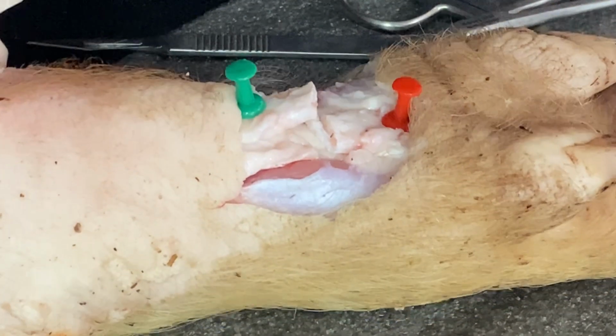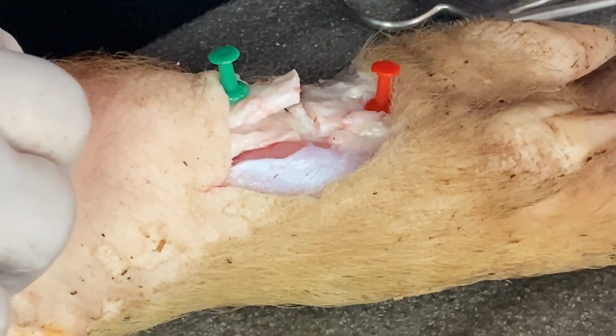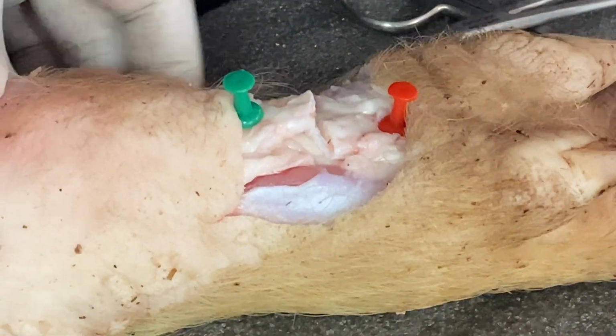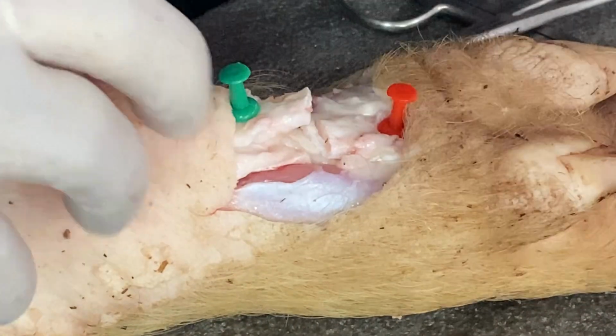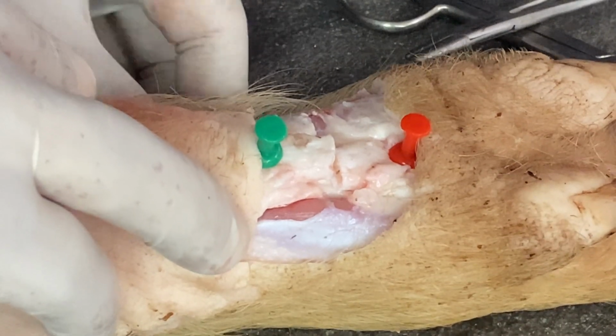The process of exploration of a tendon is making a longitudinal incision followed by searching for the hematoma. The hematoma will surround the end of the tendon. It will be present inside the paratenon. Paratenon is the blood supply of a tendon. Got my point? Now let's go on to repair.